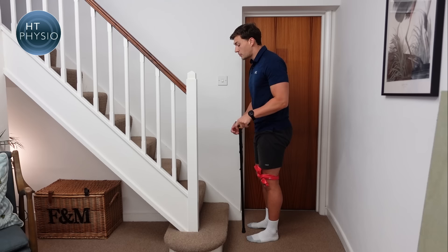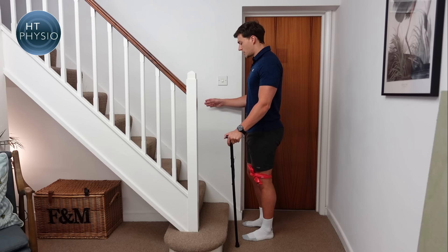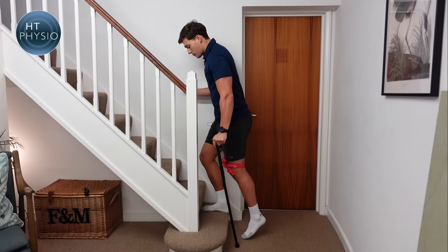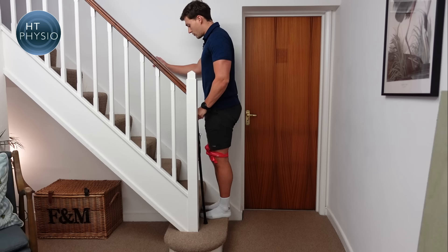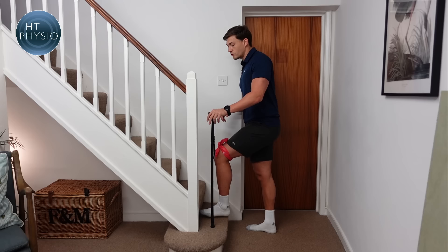Now let's pretend the handrail is on the right side instead. We swap the stick over to the other hand and hold the handrail on the right side — nothing else changes. We're still going to move the good leg up first, and the stick and bad leg always stay together. So: handrail on the right, good leg up first, then pull with the handrail and push with the stick as the bad leg goes up at the same time. I like to time it so the stick lands just ahead of the bad foot.